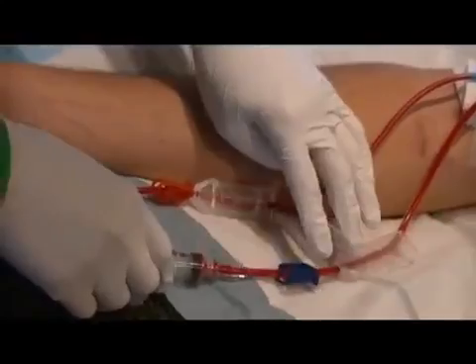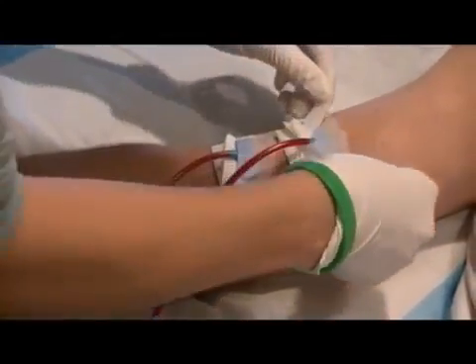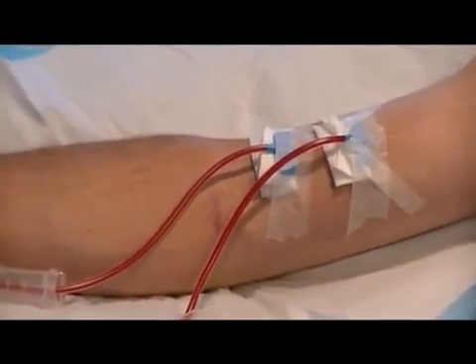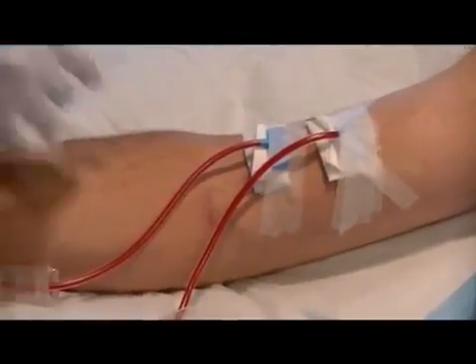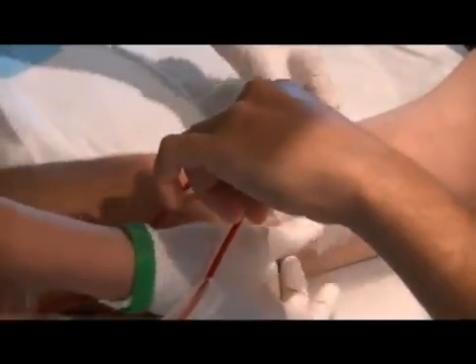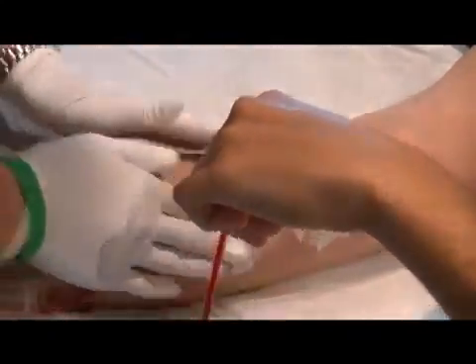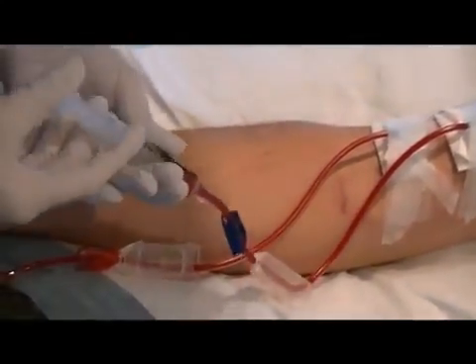Okay, and then I will tape them down better after you make sure that they're in the right place. Do your little horseshoe. And then one over the top. And then once you tape them down, I always double check that I'm still in the right place so that the needles haven't moved too much.